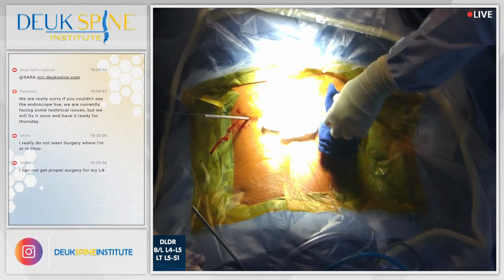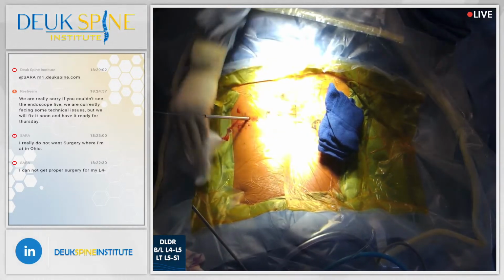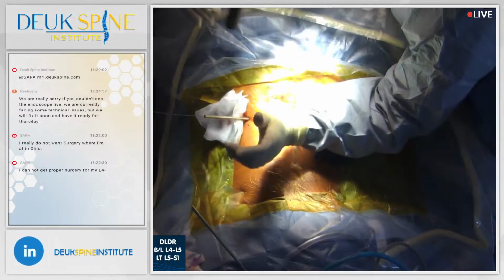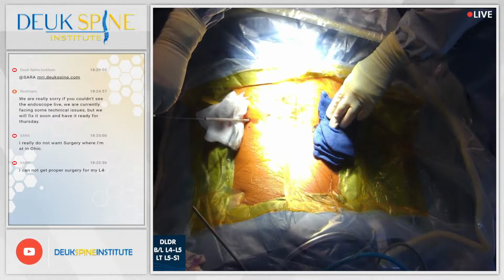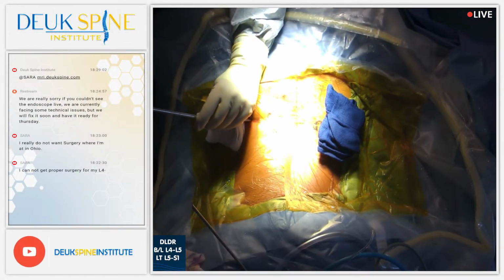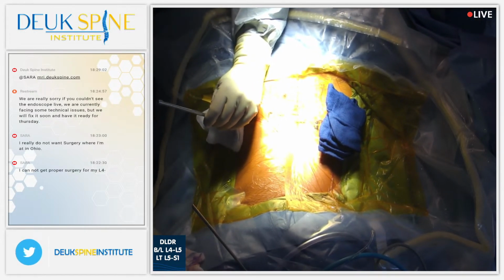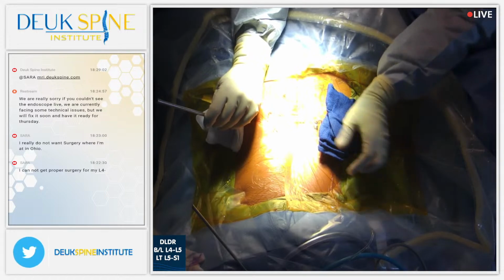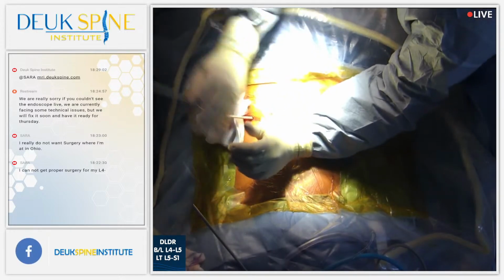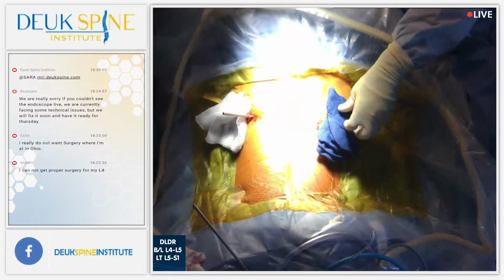Shot? You can feel the herniation. Time to push it back in. Shot. All done.